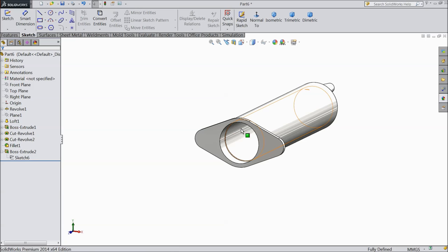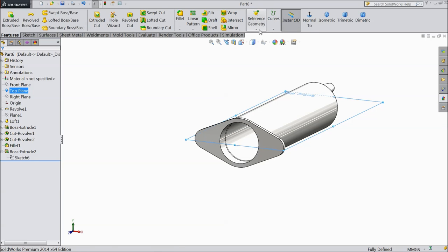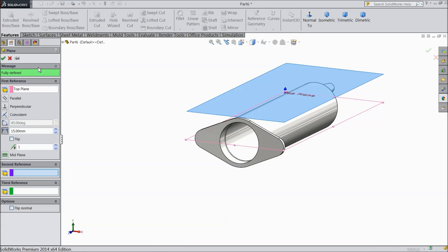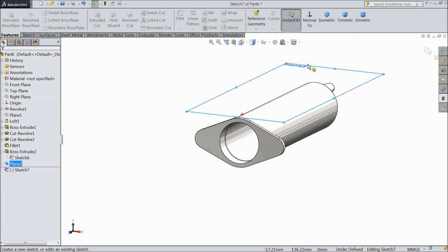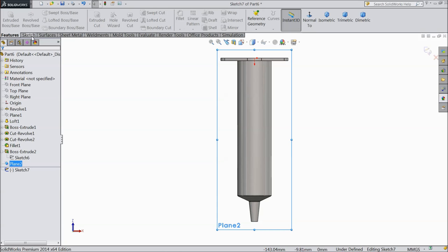Now we want to make a scale on the main body. First we will create one plane — choose top plane and create one plane 15mm above the top plane. Now select this plane, sketch, normal.